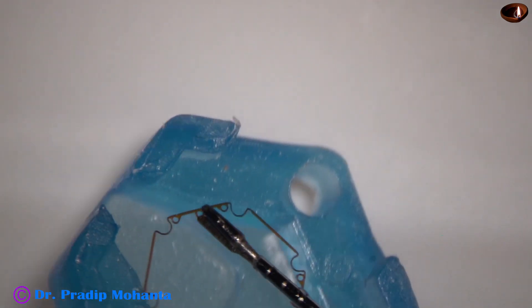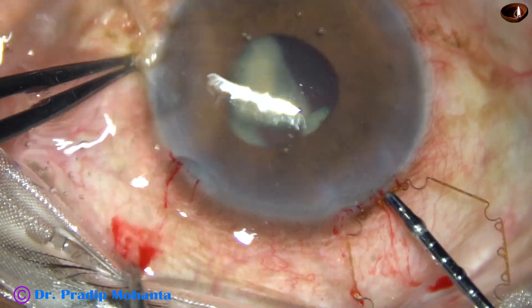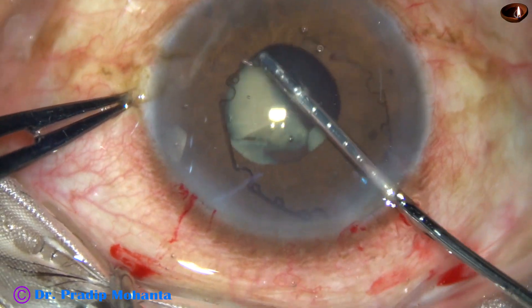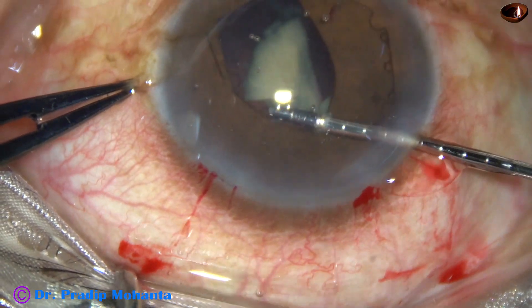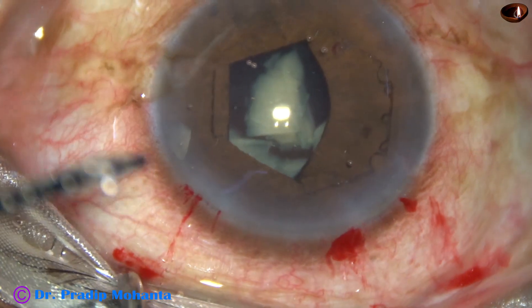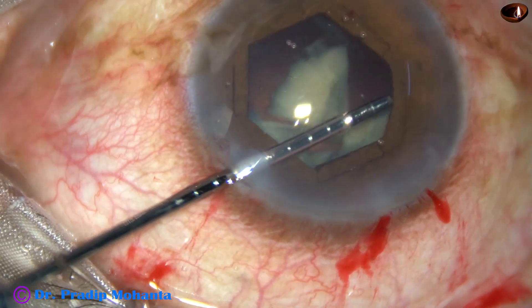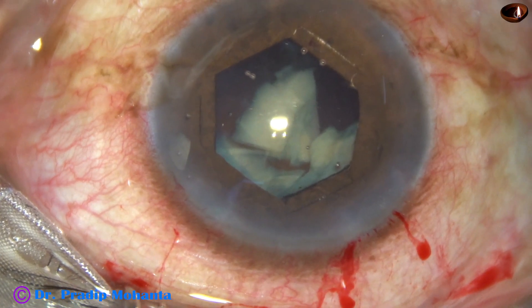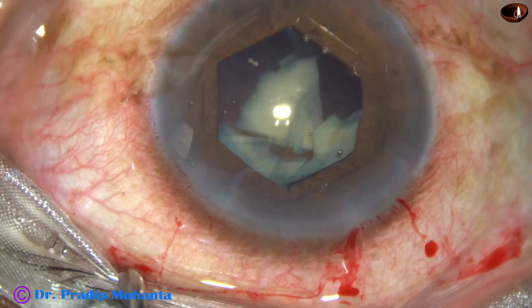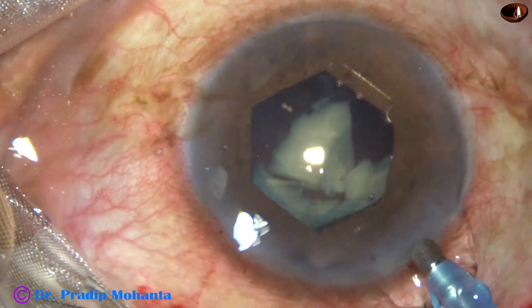This is the pupil expansion device at hand — this is B-hex, invented by Dr. Subhan Bhattacharji of Kolkata. The anterior chamber has been filled up with visco. Now the B-hex goes in, and in one go the leading flange is tucked, and the flange at 1 o'clock is then tucked. Now going through the left side port with the B-hex forceps, the flange at 10 o'clock is tucked. This is real-time — it takes this much time to apply the B-hex pupil expander, because no injector system is required. Now the size of the pupil is about 5.25 mm, and it will be very easy to manage the case now.